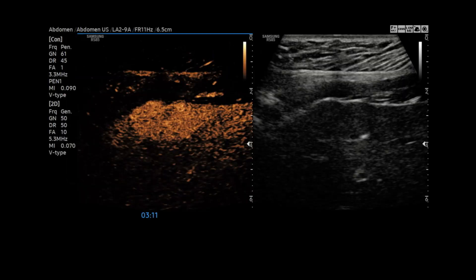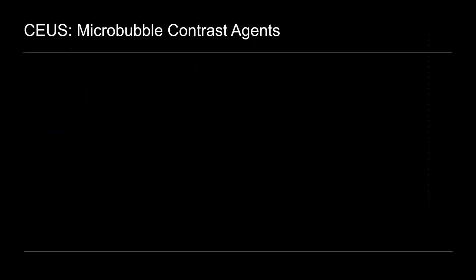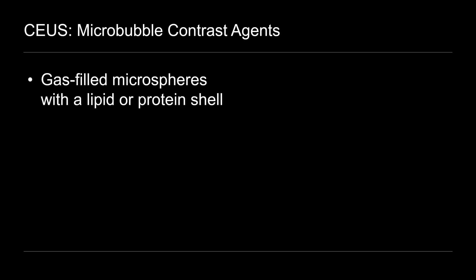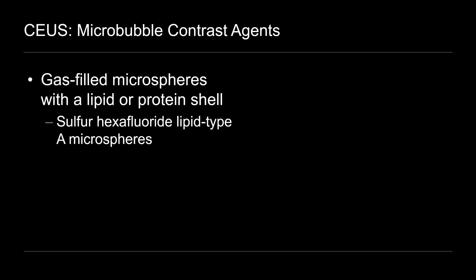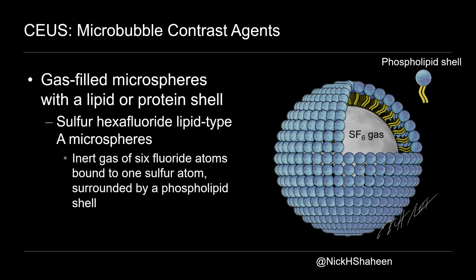This image is showing the lesion about three minutes after the time of contrast injection. On contrast ultrasound, this would be the late phase or equilibrium phase, which starts after two minutes. And you can see that the mass remains hyper-enhancing relative to the surrounding parenchyma. There's no evidence of washout, which is something we look for on contrast ultrasound, as washout is typically a finding of malignancy, meaning that the lesion will become darker relative to the surrounding parenchyma. And just a reminder, the agent we use for contrast ultrasound are micro-bubbles, which are gas-filled microspheres that have either a lipid or a protein shell. In the example that we just saw, the agent was sulfur hexafluoride lipid type A microspheres, which is an inert gas of six fluoride atoms bound to one sulfur atom, and that's surrounded by a phospholipid shell.